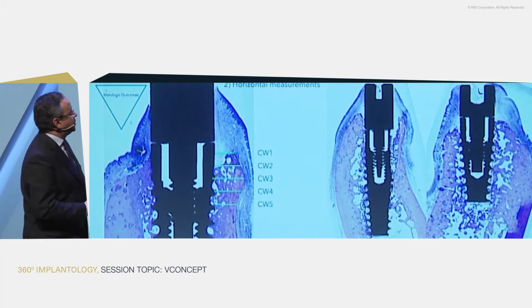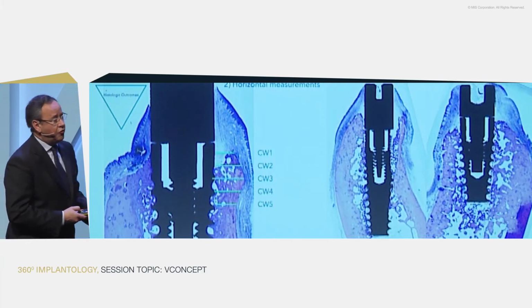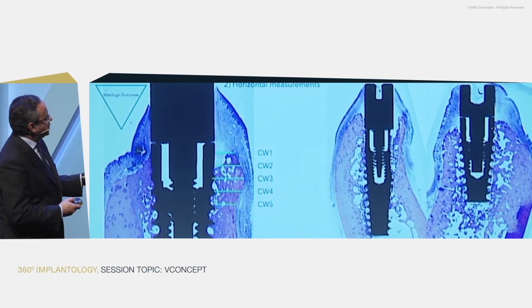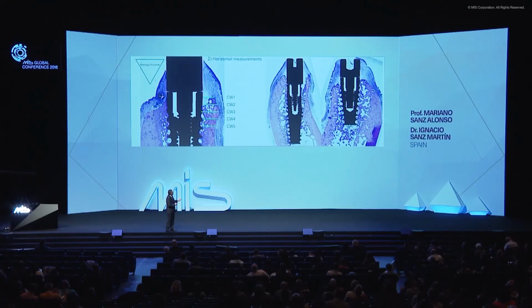And here you have 2 clear examples of this V3 specimen, where we have quite an important width, and this control specimen that also has a certain width, and therefore we are going to measure what happens here, 1, 2, 3, and 5 millimeters below.